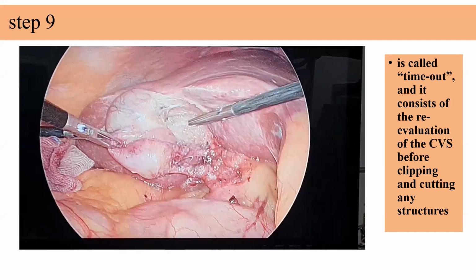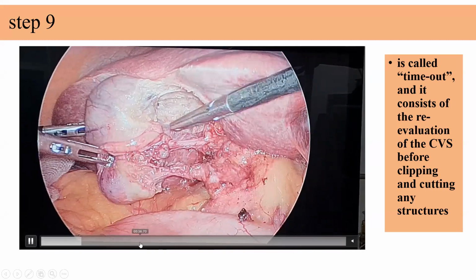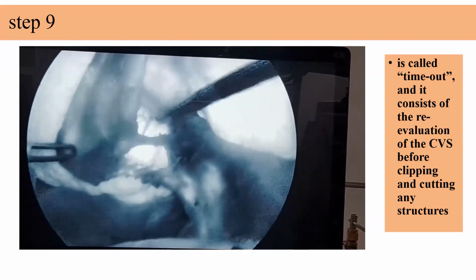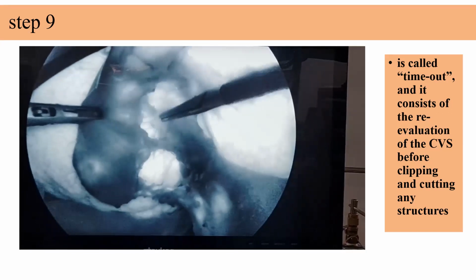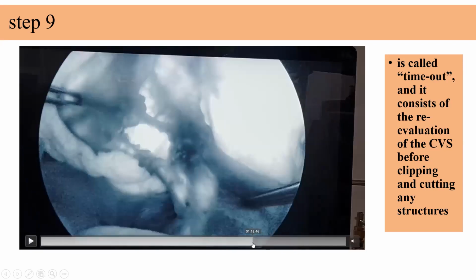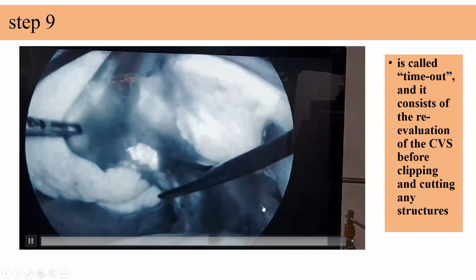So this is a video of the critical view of safety intraoperatively with the help of ICG and with the help of green white light. I will just fast forward it so you can see how the confluence of the cystic duct with the common hepatic duct is identified, and all 6 marks, 2 marks each for the cystic duct, the artery, and the clearance of the lower 1/3 of the gallbladder fossa. So that is how it is well identified with the help of ICG. This is very important to prevent catastrophe during gallbladder surgery. So anterior and posterior views both are to be identified properly.